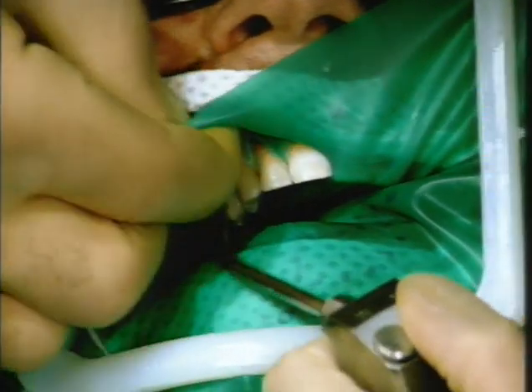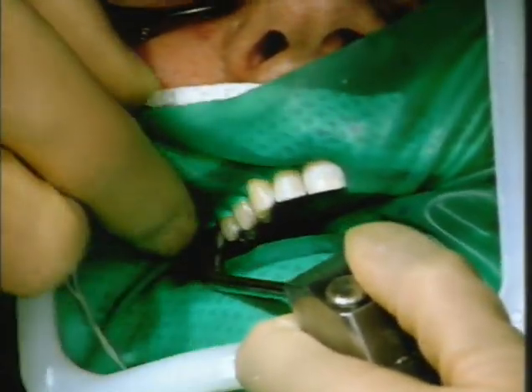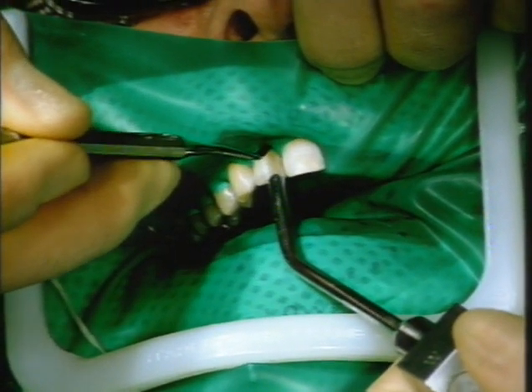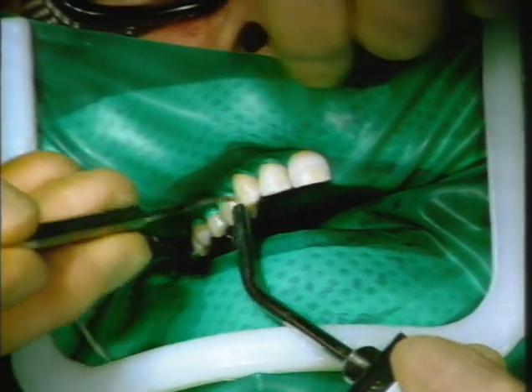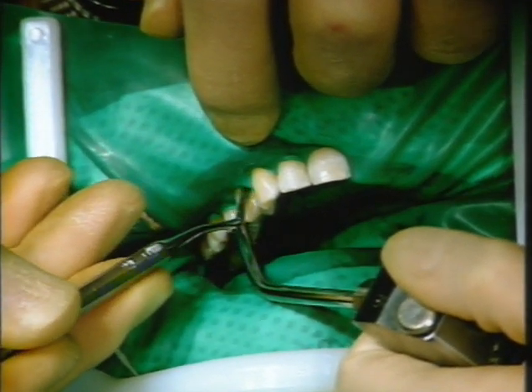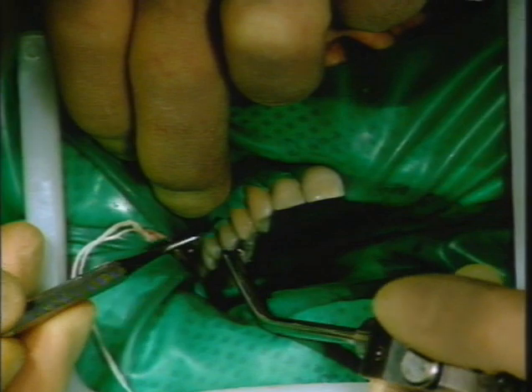A lot of air is very helpful when it comes to everting the rubber, and I can see on the canine it has everted quite satisfactorily, but on the other teeth it's going to just need a little push with the blunt instrument. Chris is moving the air along as he goes. Very important here. It looks as if the rubber might be just caught in the contact points between the 2 premolars, so that if it doesn't evert there, that would be the explanation.